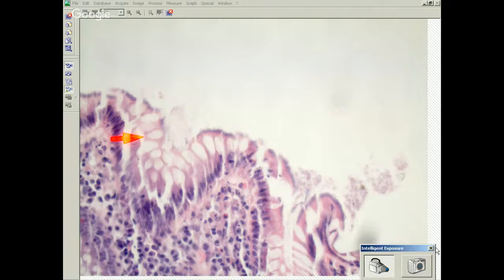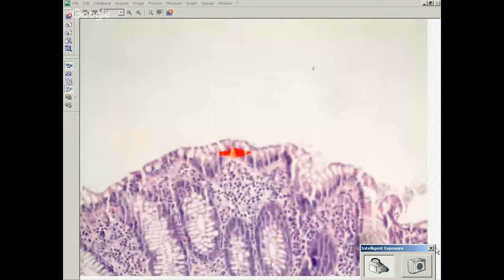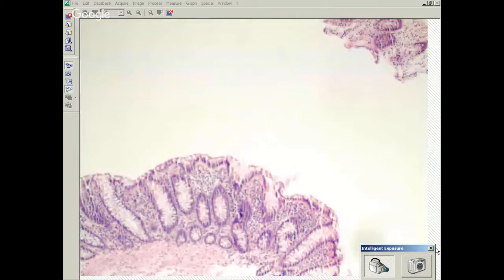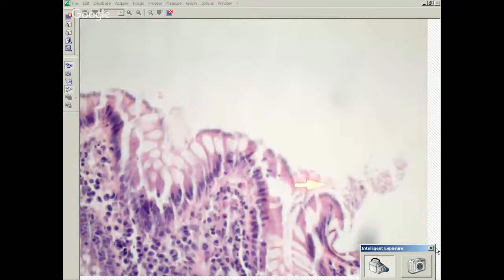So when you have a patient that might be immune compromised and you know that they have diarrhea and everything actually looks normal on low power, there's really very little inflammation, just go on higher power and make sure that they don't have spirochetosis. There's no active inflammation. It's a little fuzzy and purple on low power, it looks like hair. Mucin doesn't look fuzzy. It looks more floppy or a little thicker, not like hair. On higher power, it kind of looks like a buzz cut, like hair that sticks straight up.